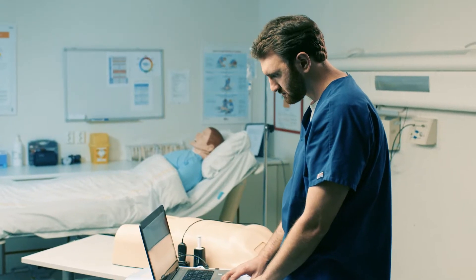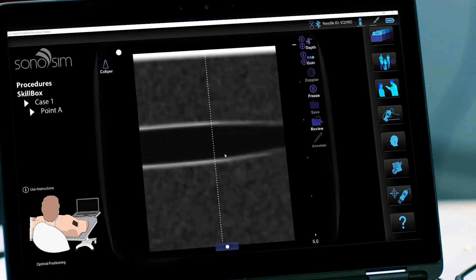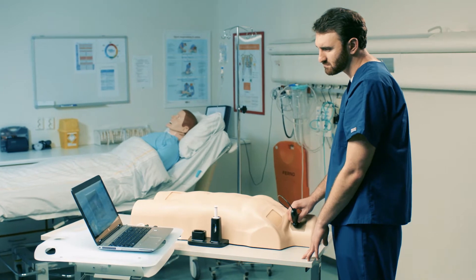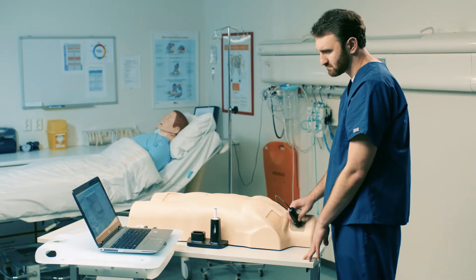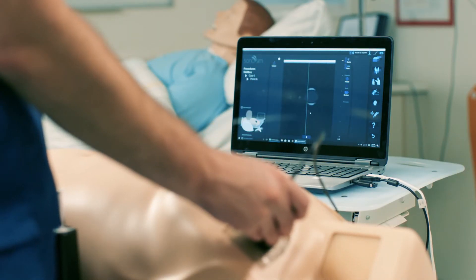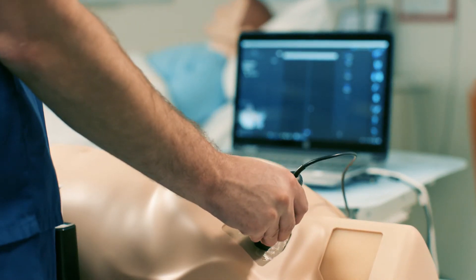The Leradol Sonosim Procedure Trainer has two unique types of cases. Skillbox cases help learners develop baseline psychomotor skills required for ultrasound-guided procedures, from vessel identification to using Doppler modalities to compression. Geometric models representing different types of vasculature give learners a focused scenario to practice their skills.